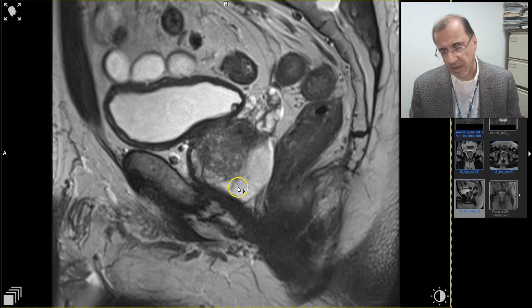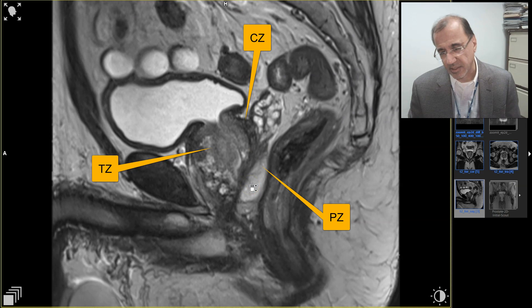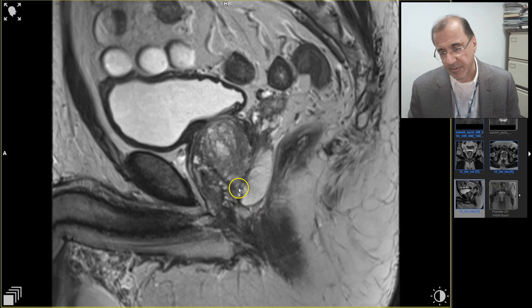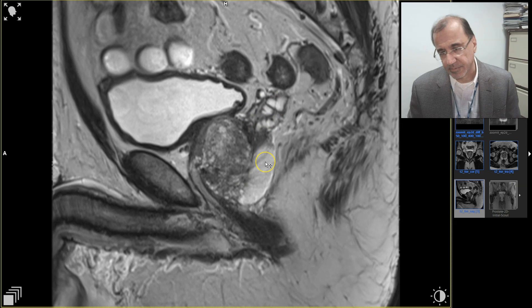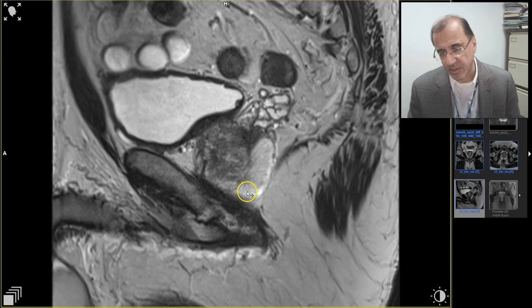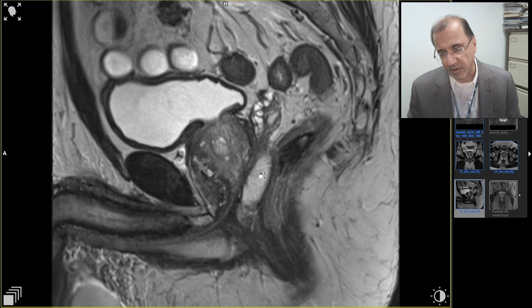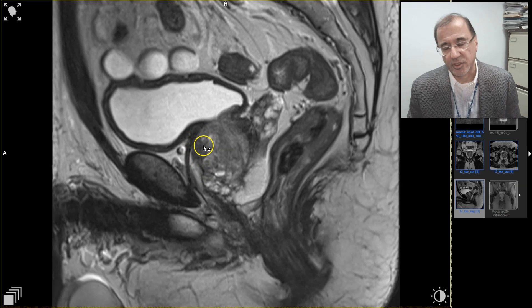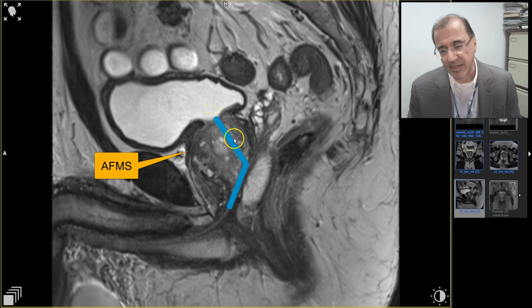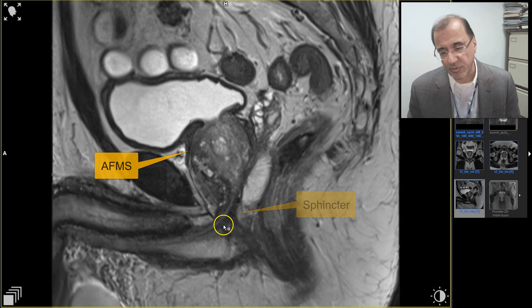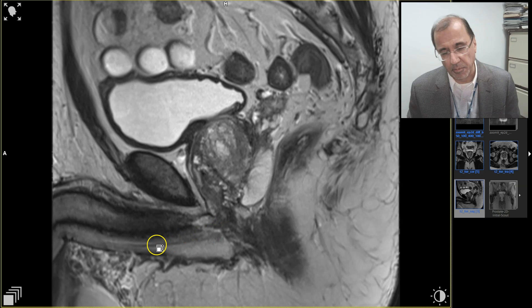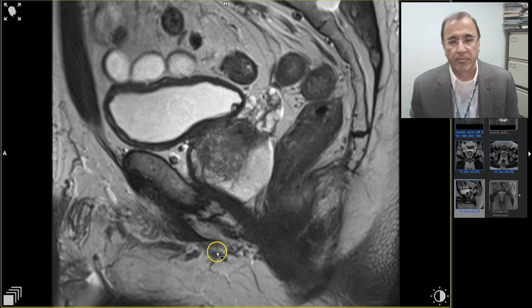In the sagittal plane going to the side: the peripheral zone, the rounded transition zone, the central zone above with seminal vesicles behind, and the two BPH nodules we saw previously. In the midline: seminal vesicles, central zone pointing downwards, the cup-shaped peripheral zone. That's the tumor in question. We can see how the urethra goes downwards, backwards, makes a corner, comes out, goes through the external urinary sphincter, through the membranous urethra, then the bulbar urethra, and into the penile urethra. These are the corpora.